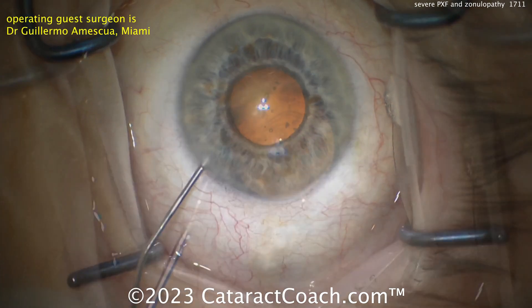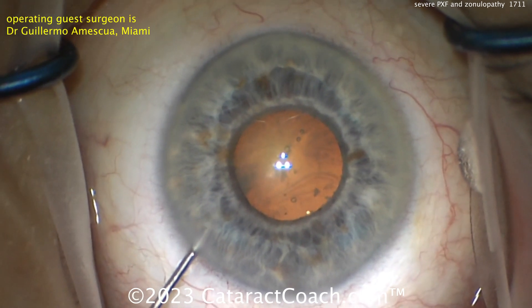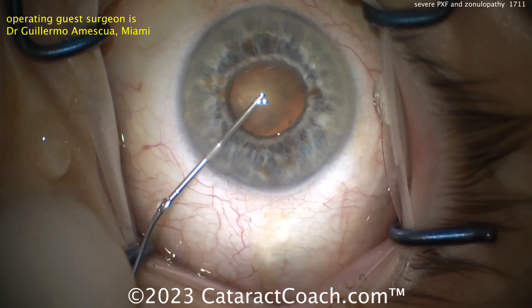As BSS is going inside the eye, there's movement of the lens nucleus. The whole nucleus moves. And that's just when you're instilling anesthetic inside the eye.